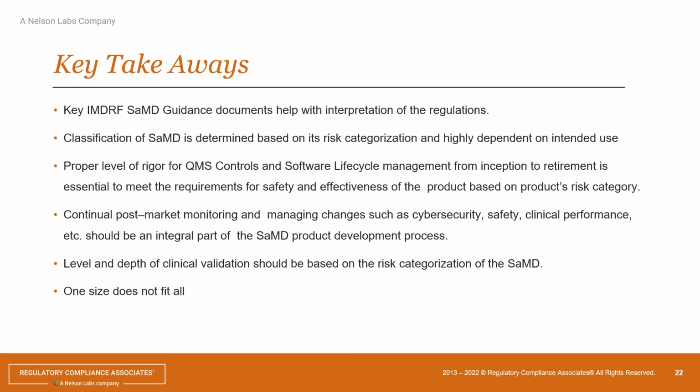Most EHRs are not considered medical devices unless they have features that make them one. So you're interfacing with a non-medical device and getting information, and you have to make sure that when they make a new release, you're aware of it and it doesn't break the client's ecosystem, which has multiple pieces of software in place.